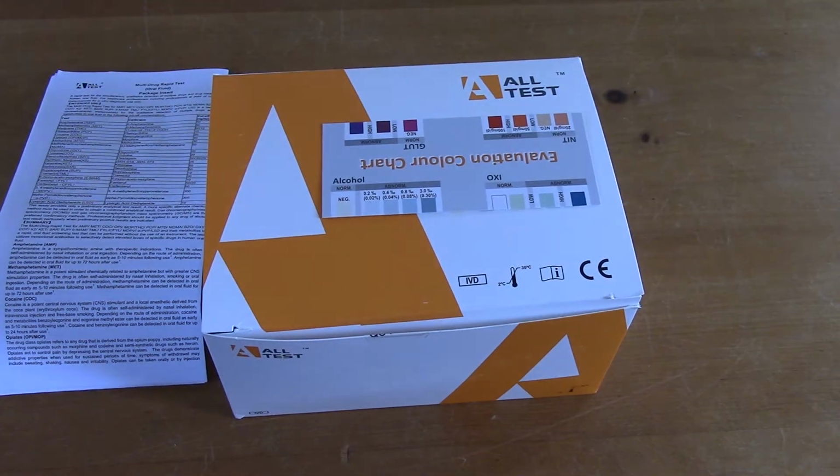This is a direct indicator at the point of testing, and the equivalent levels that you're given there are blood alcohol equivalent levels. So 0.08% is the obvious UK drink driving legal limit. 0.02 is zero tolerance level.